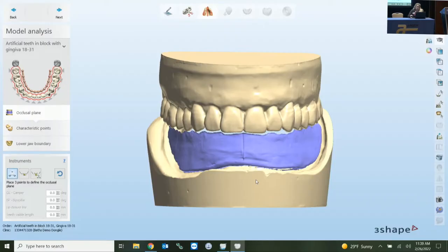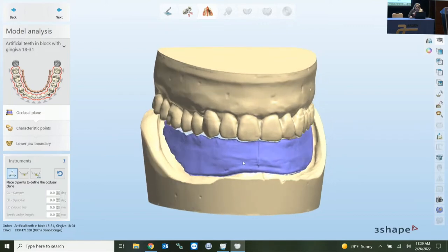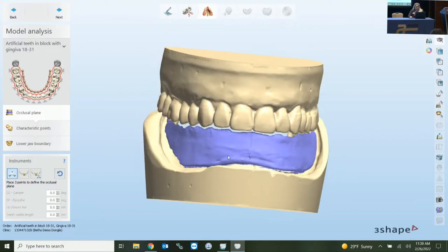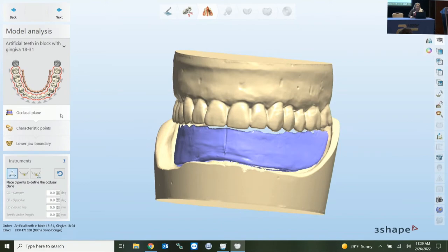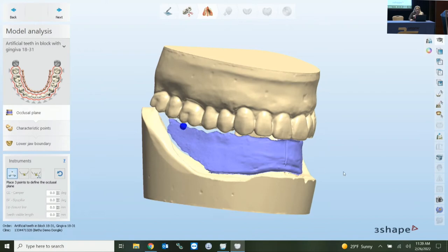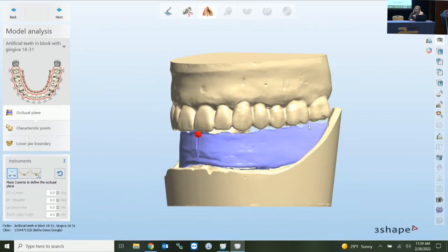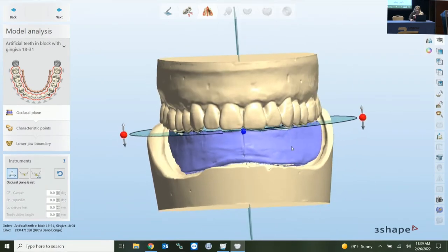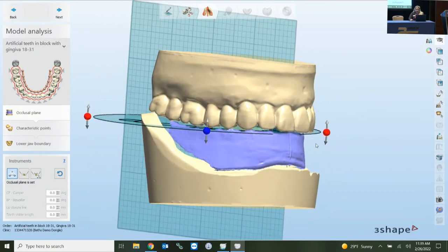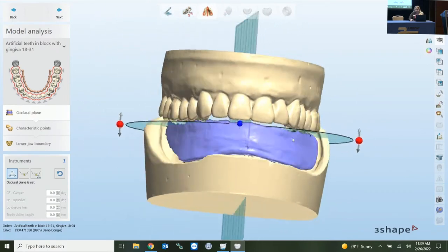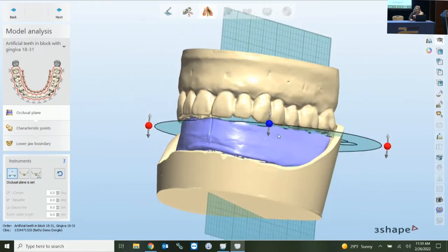I've opened up a denture workflow and the first thing we start with is the model analysis. It's asking us for the occlusal plane first, so we click on the right side posterior, the midline, and then the left side. It inserts the occlusal plane and sagittal planes, which you can adjust as needed for the case you're working on.